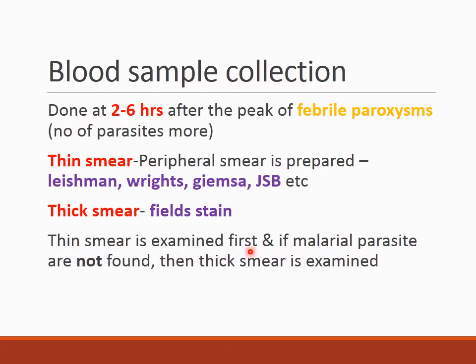Thin smear is examined first. Usually the thin smears are done and should be examined first, and later if the thin smears do not show the presence of malarial parasite, then we need to prepare the thick smear, and this should be stained and examined.